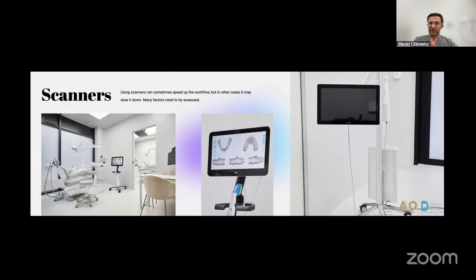So another problem where you can create a block in the whole treatment is scanners. The idea is they want to help your projects, because they create a 3D scan, and they send this element very fast from the office to the laboratories or a different place, to another place on our planet. But sometimes problems appear, so let's go inside the problem. The problem appears here.